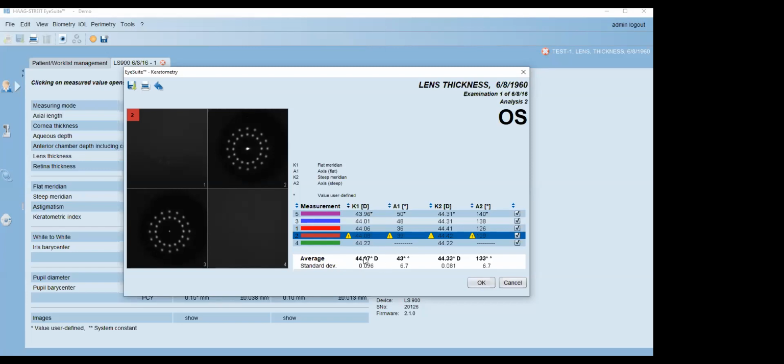So is there any reason to delete? Not in this case. So if you're seeing a caution during a measurement and a single caution appears next to an average K, first check the standard deviation, and here's where we can identify if we need to delete or remove.